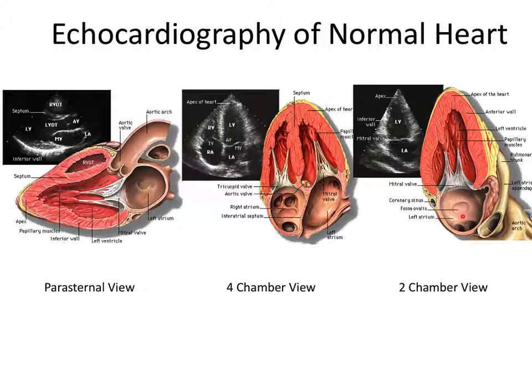So essentially, in these three views, you see 6 independent chunks of the left ventricular muscle, because each one of these views is rotated about 60 degrees or something like that. Okay. Is that pretty clear? Good.